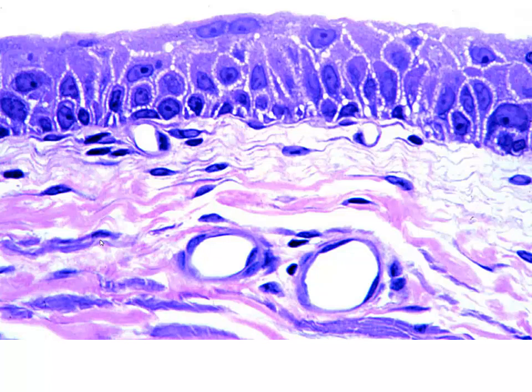In males, we will have the prostatic urethra. So if you see glandular tissue completely surrounding a lumen, then you know it's urethra and it's prostatic urethra. If you see the urethra within the corpus spongiosum in the penis, once again, that's an easy tip-off that you're looking at the urethra.